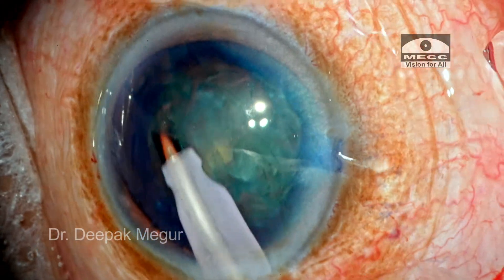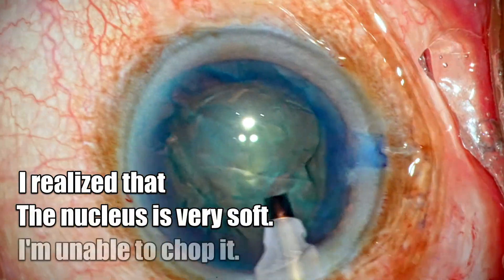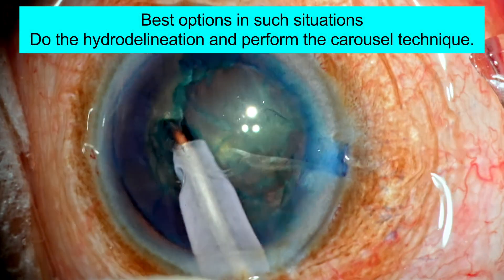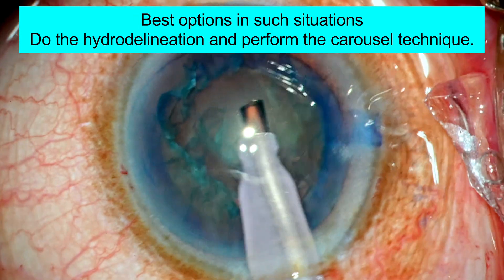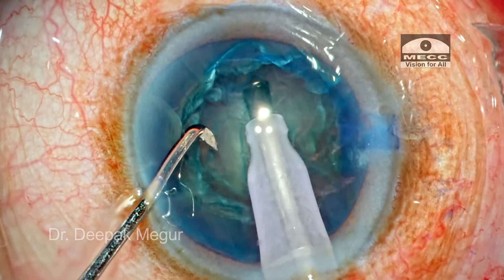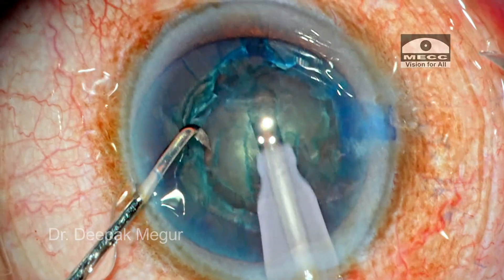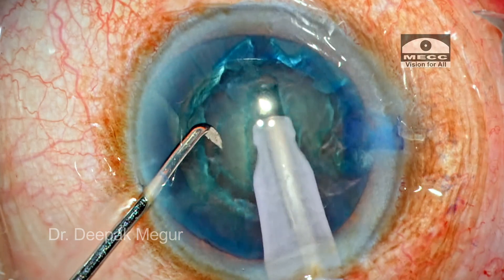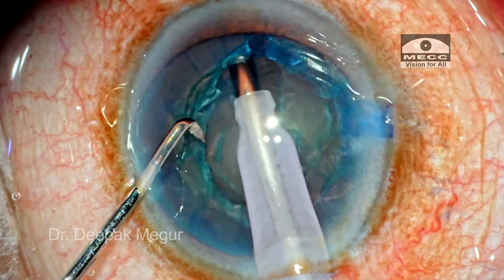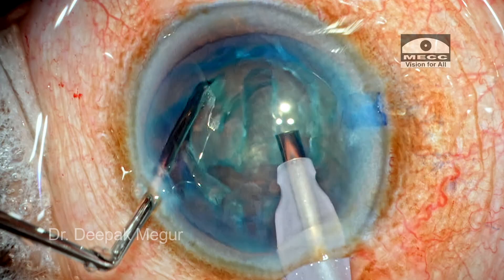The superficial epinucleus is removed, and as I am removing it, I realize this is a soft nucleus and I will be unable to chop. The best solution would have been hydro delineation and prolapsing the nucleus out using a carousel technique. Since I haven't done hydro delineation, I will try the stop-and-chop technique. I go in and do my sculpt, broadening the peripheral ends so it's easier to remove the heminucleus out of the bag. The nucleus is rotated, and the trench is slightly deepened and broadened at the distal parts.